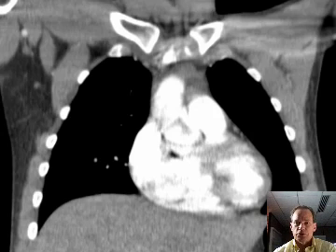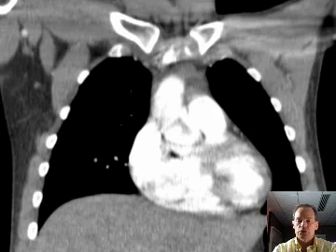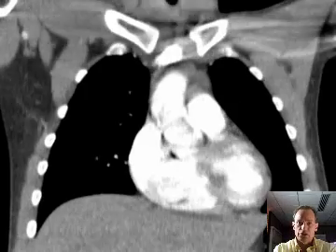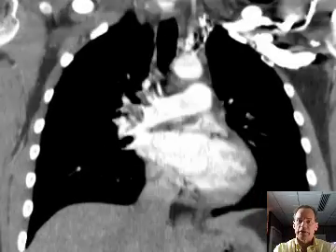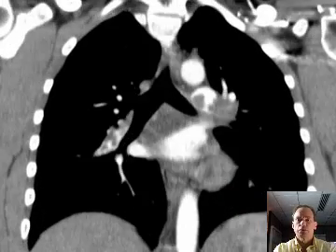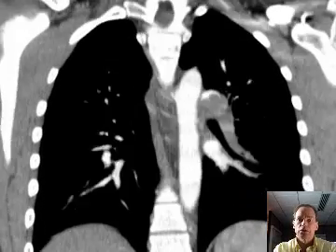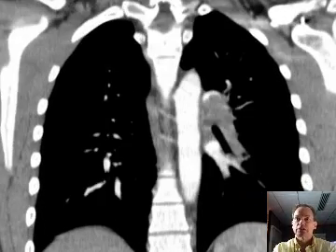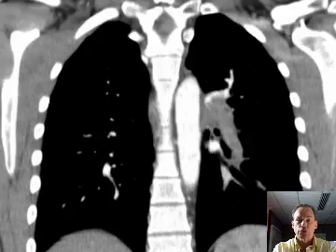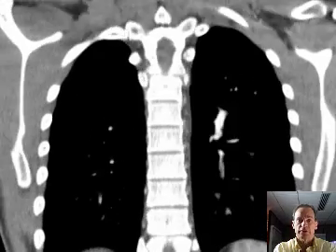Hello there, Dr. Mintz here. This is an interesting case of a 22-year-old male who had sudden onset of shortness of breath.